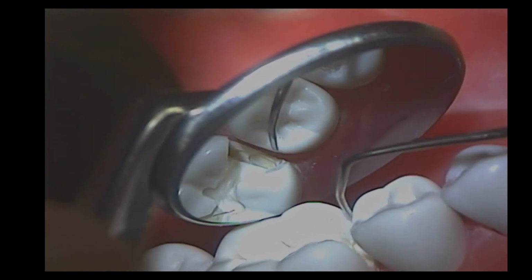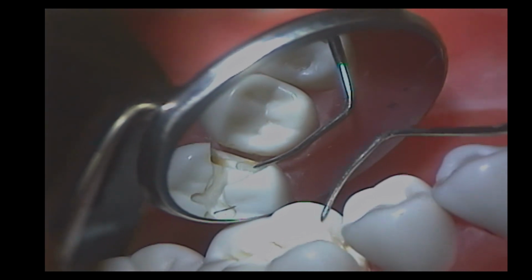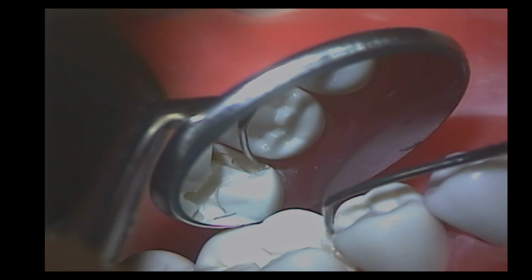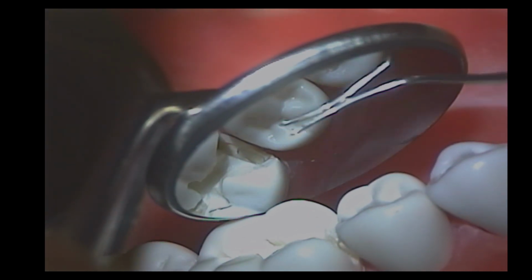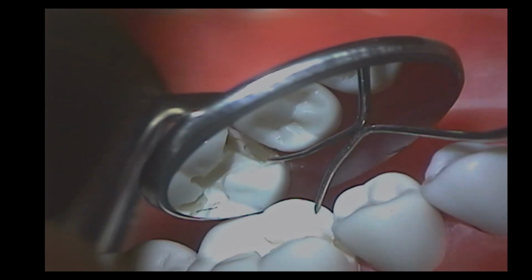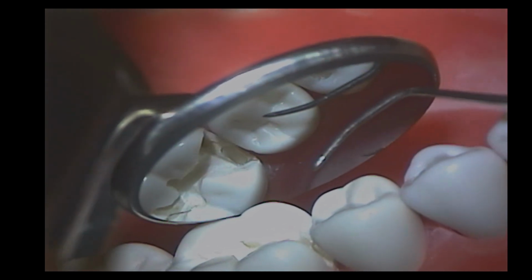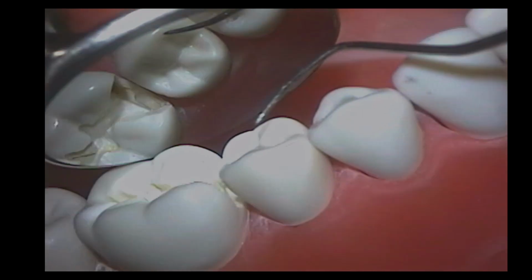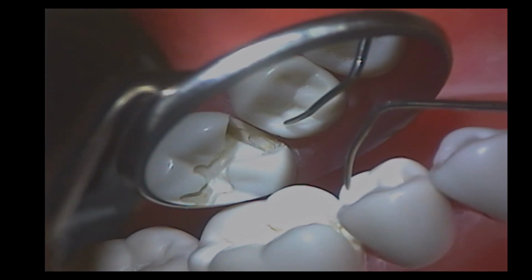The only area that would fail you is probably the occlusal third being a little bit acute, but especially that gingival part right there. For amalgam prep, that bevel would compromise the marginal integrity of the amalgam in that area. But basically, if you were to use a hand instrument at this angle all the way from the occlusal to the gingival, you could take care of a lot of those problems in about 10 seconds or so. So that would be fine.